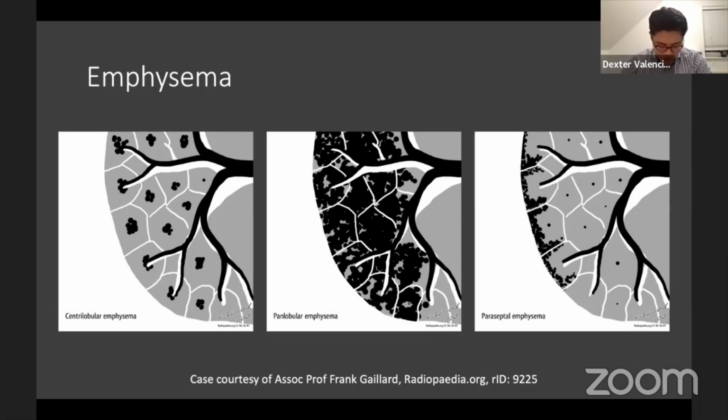Oh, how soon will the findings appear on X-ray for aspiration? I don't think there's a rule that we normally see in terms of X-rays. It's not something we think about. Normally if they have an aspiration, in my institution at least, they would get an X-ray, and I normally see it on the same day.